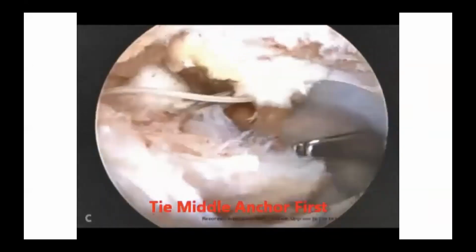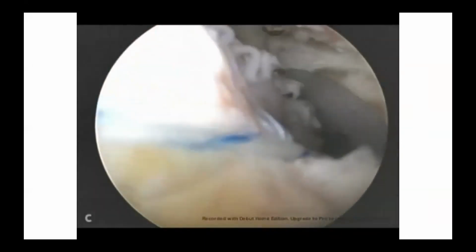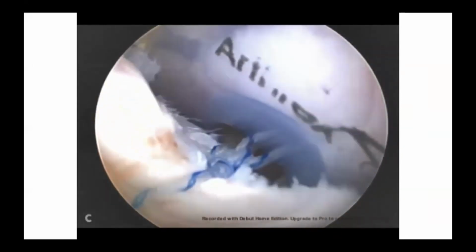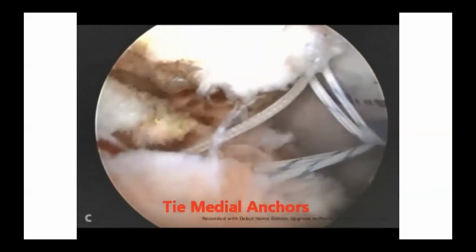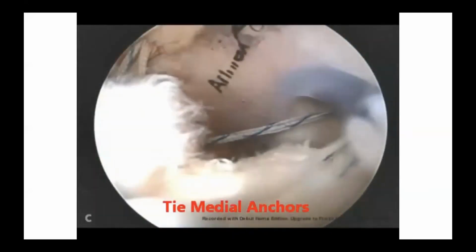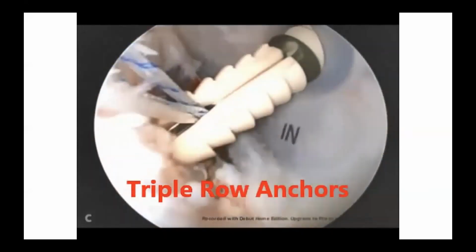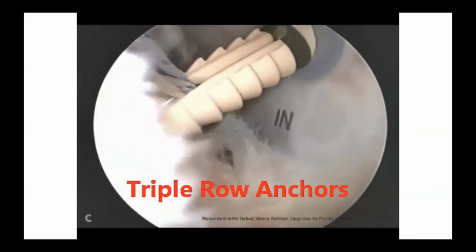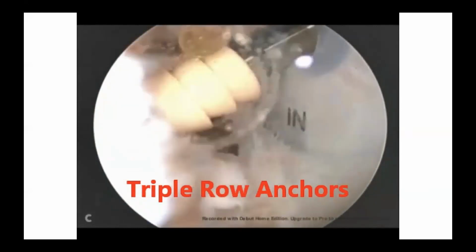And we use this anchor to make a reduction of the cuff into the footprint without any tension on the medial anchor. And we suture this anchor, cutting one strand from the remaining suture of each color. Then we tied the medial mattress sutures. And finally taking the strands, the medial and middle, into the two lateral knotless anchors.